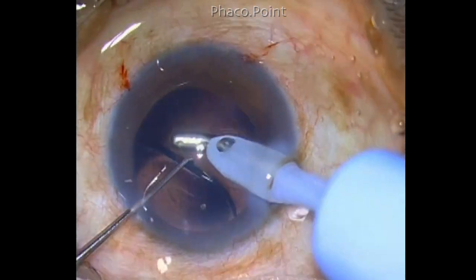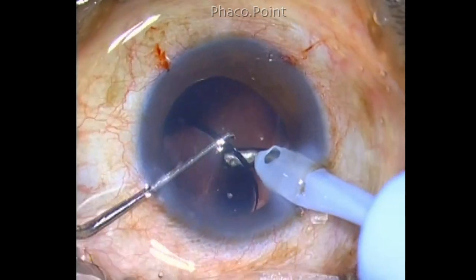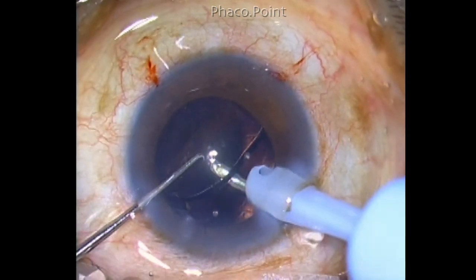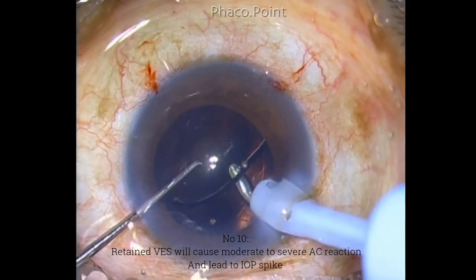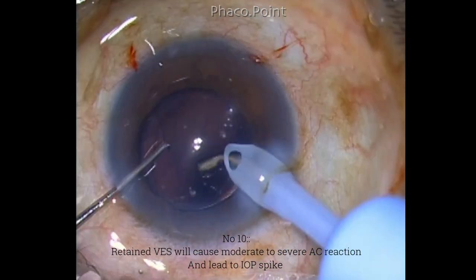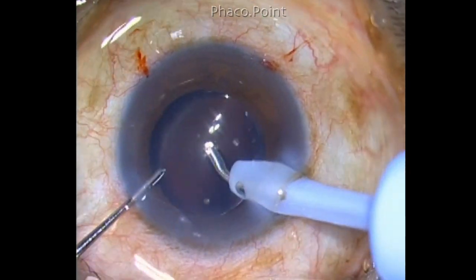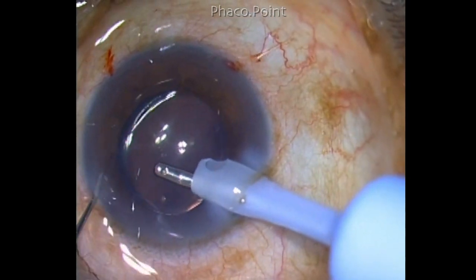Once the IOL has been injected, evacuate all the viscoelastic from within the capsular bag and also within the anterior chamber. Retained viscoelastics can not only produce a postoperative inflammatory response, they can also cause the intraocular pressure to spike up in the postoperative period.